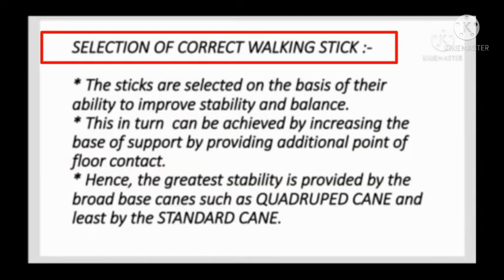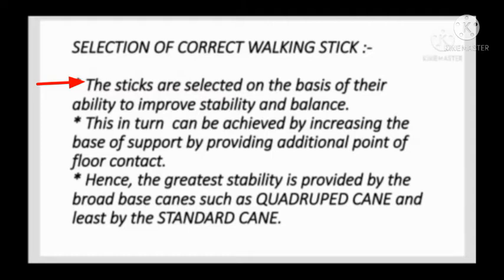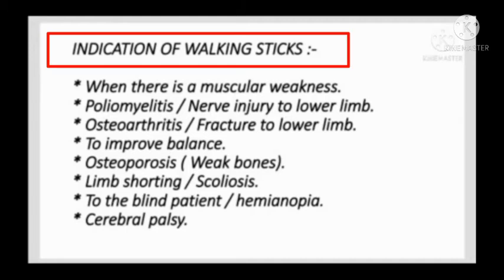cane. Selection of the correct walking stick. The sticks are selected on the basis of their ability to improve stability and balance. This in turn can be achieved by increasing the base of support by providing an additional point of floor contact. Hence, the greatest stability is provided by the broader base cane, such as the quadruped cane, and the least stability by the standard cane.